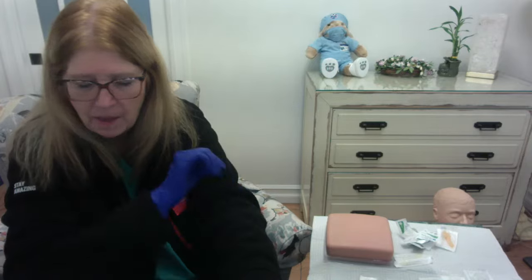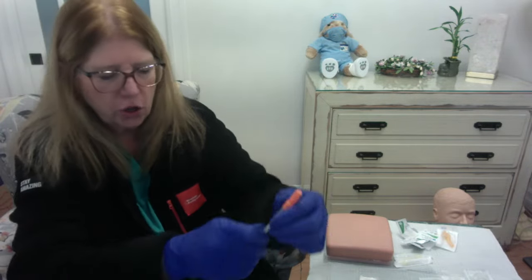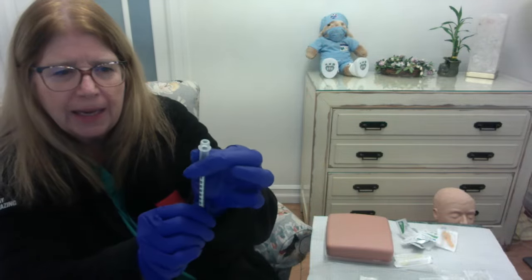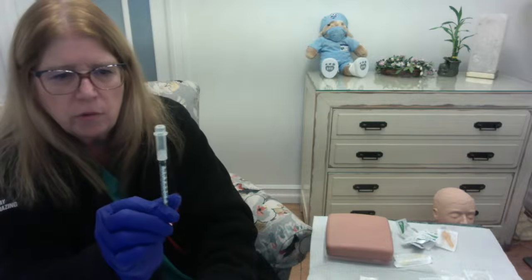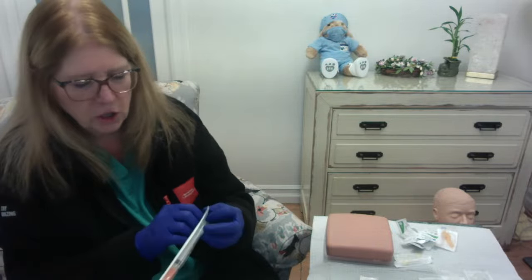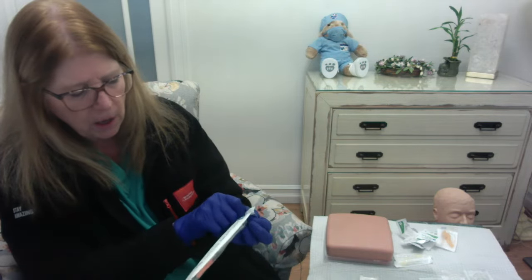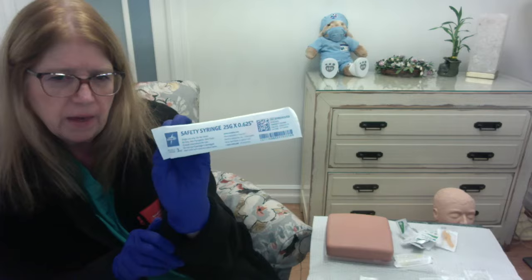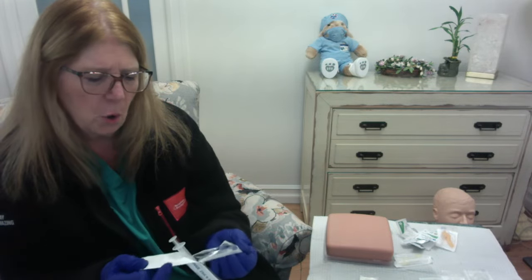So let's say that we have a different medication to give. So actually I can show you this because I have another syringe to use. So this pulls up and it clicks into place, okay? So it has covered your needle, all right, to keep you safe. And then this goes in your sharps container. All right, so I actually have another subcutaneous needle and syringe here. This is a 3 milliliter syringe with a 25 gauge needle that is 0.625 inches in length. So again, pretty small needle.